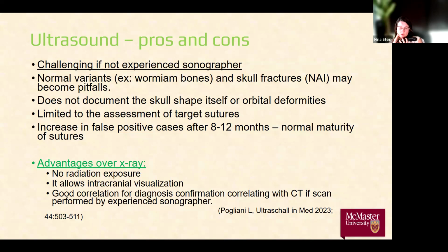And then there are some pitfalls, right? We know that the skull has several different variants that can occur, and you need to be familiar with how they look and the location of those when you're scanning, so you don't fall into a pitfall.